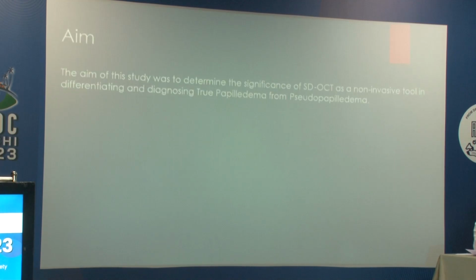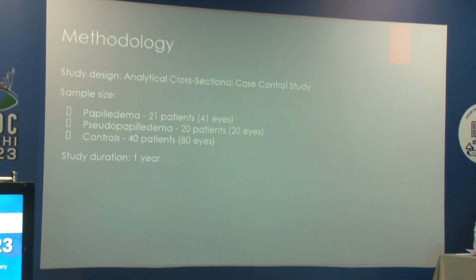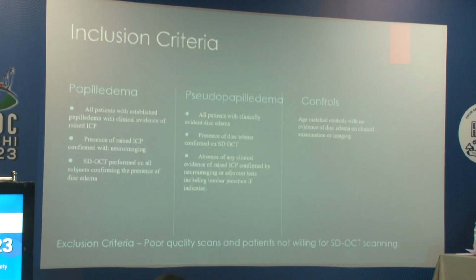In our study, the aim was to determine the significance of SD-OCT as a non-invasive tool in differentiating and diagnosing true papilledema from pseudopapilledema. The methodology: our study design was an analytical cross-sectional case control study. Our sample size was 21 patients with papilledema, 20 patients with pseudopapilledema, and 40 controls. The duration was 1 year.